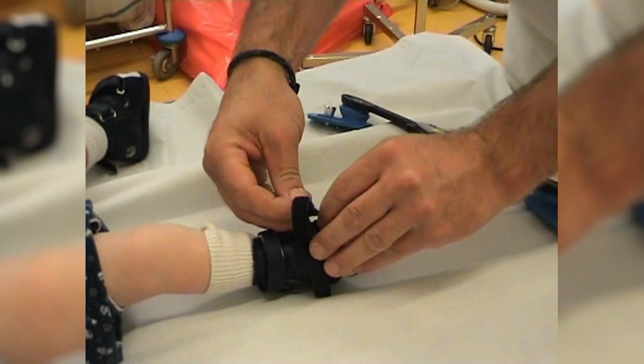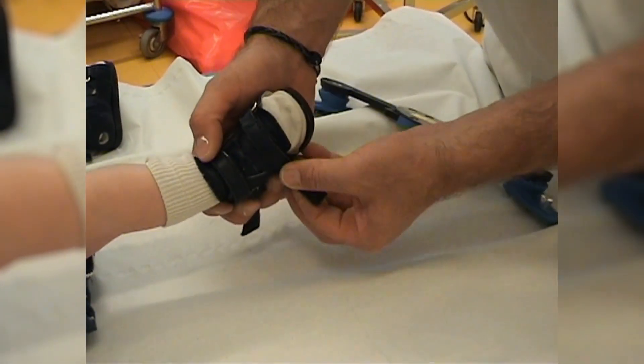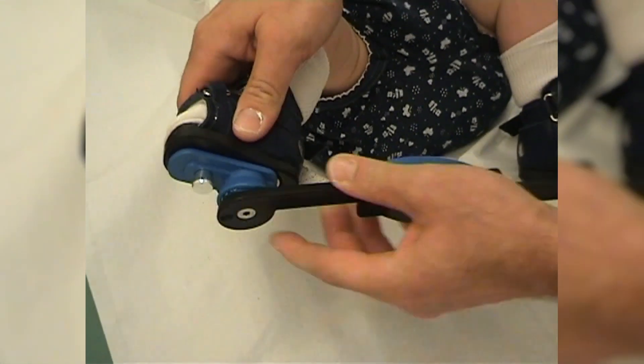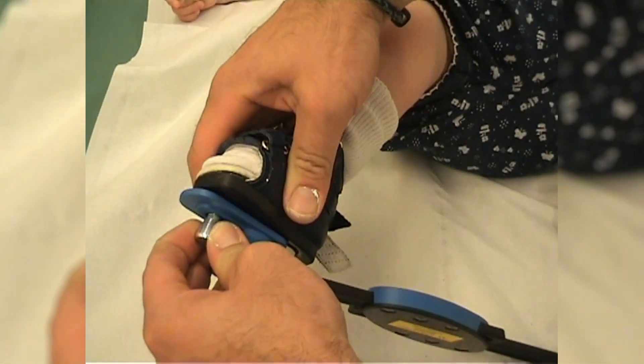The proximal and distal straps on the other hand do not need to be as tight. After having put on both shoes, you can connect the shoes to the AlphaFlex brace via the click system. It is just as easy to remove the shoes from the brace.